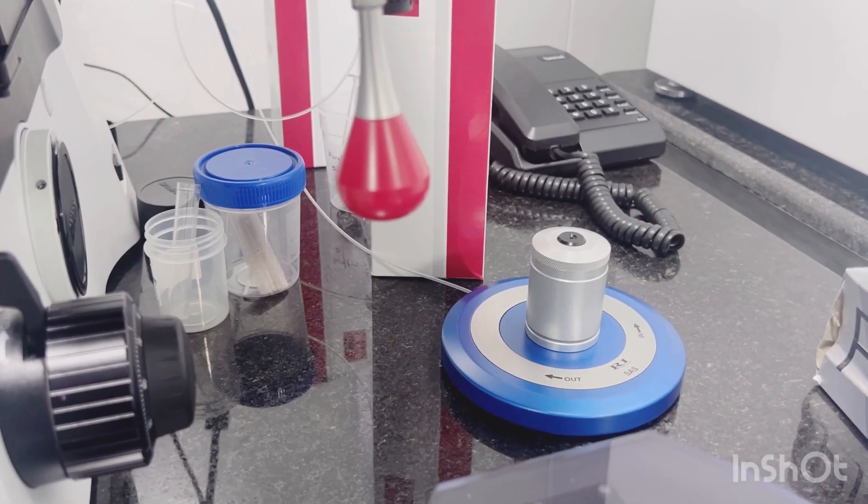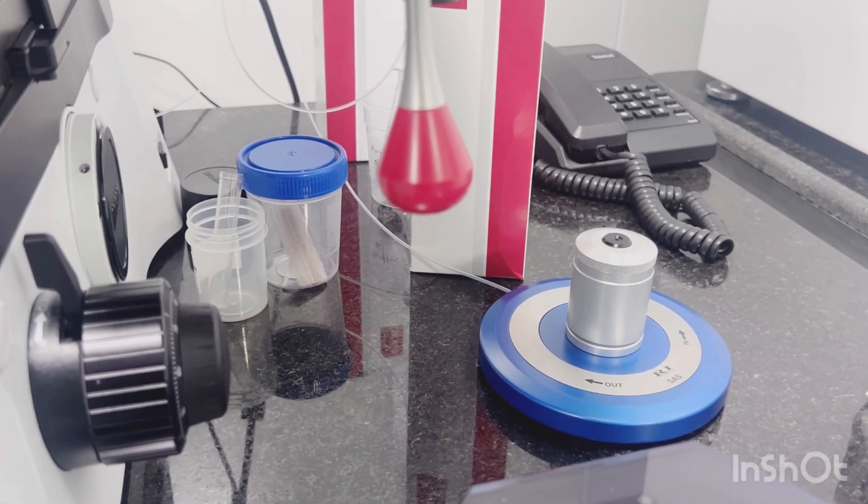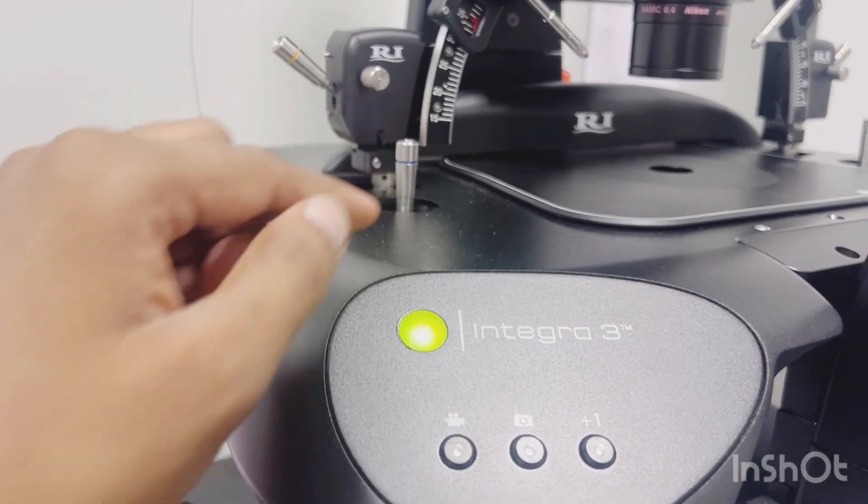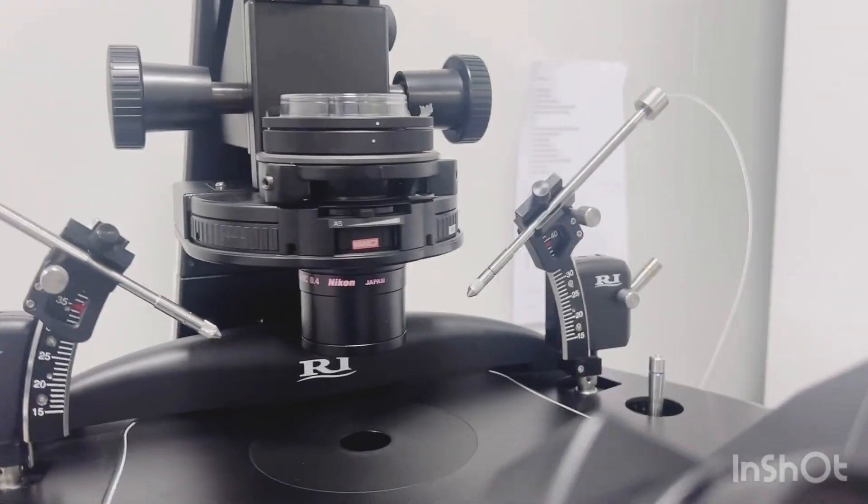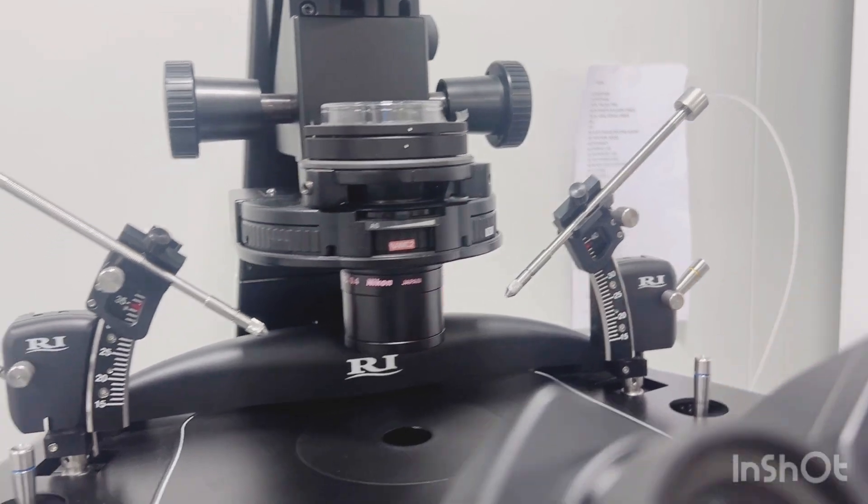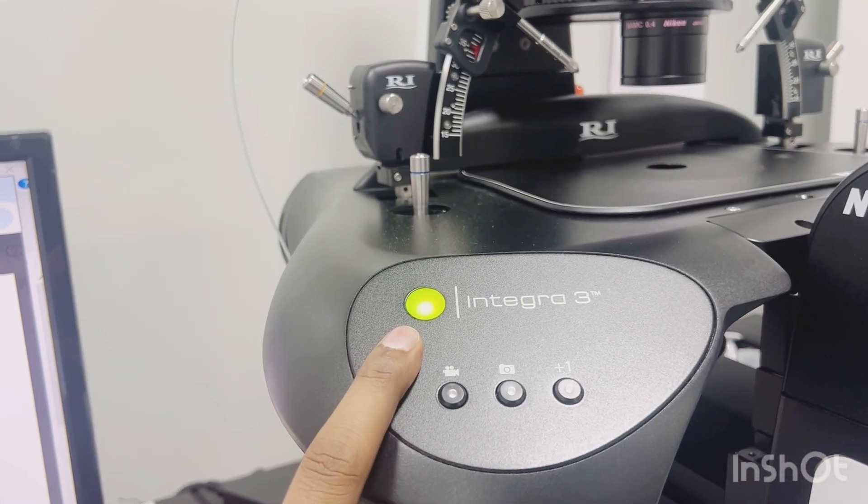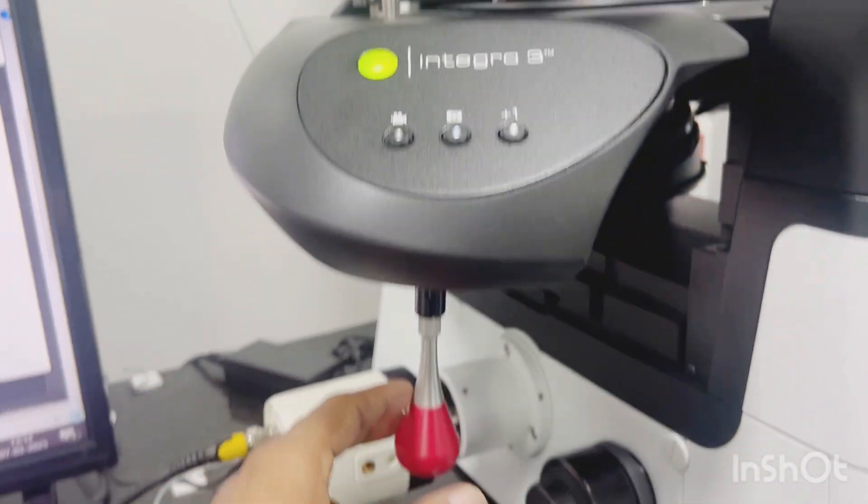The whole SAS - that is Screw Actuated Air Syringe Assembly - has coarse control levers on the left side and right side. This is the status indicator light.